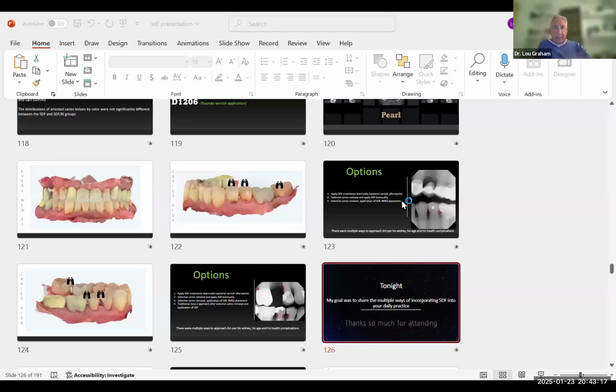I don't care whether you're total etch or selective etch, because I've been a total etcher forever. If you total etch and you place your bonding agent in and you scrub it in for 20 seconds, follow the directions, and now you're about to air dry. So you're going to etch, rinse, blot dry, not air dry. Now you're going to place your bonding agent.